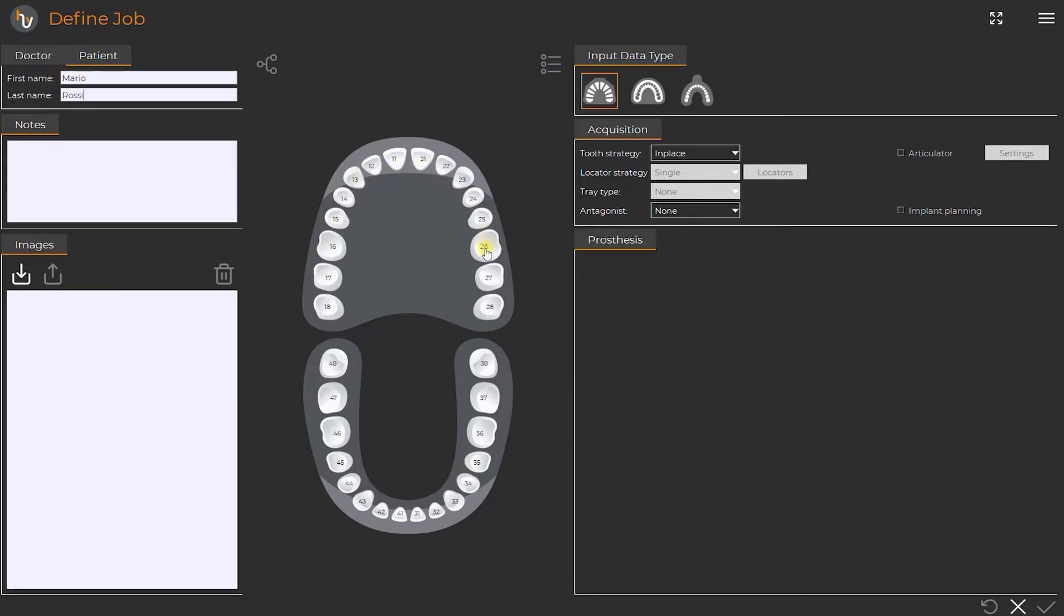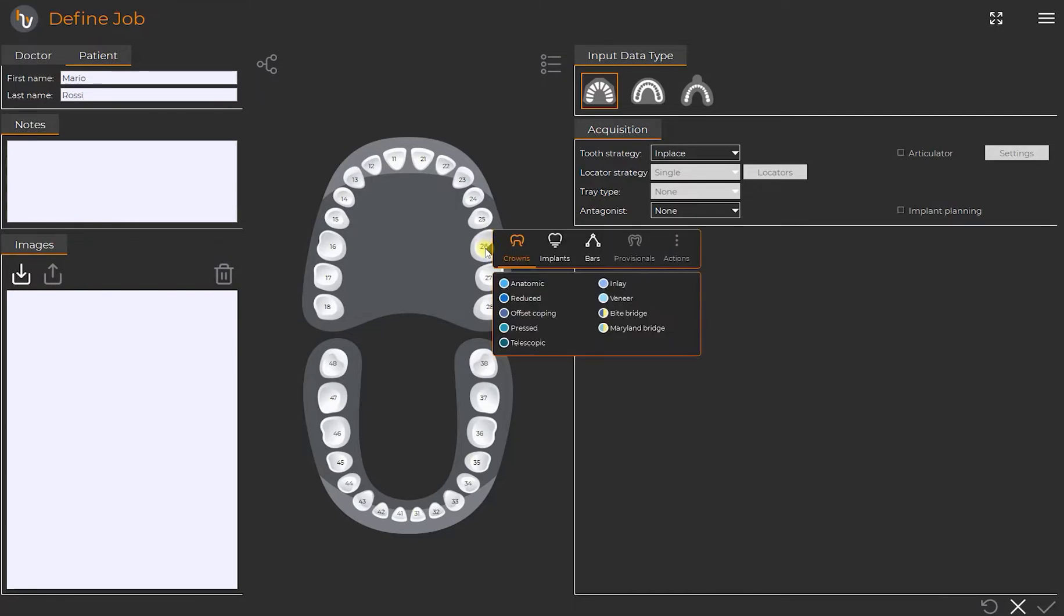We right-click and select the tooth 26. From the drop-down menu we choose the kind of fixed prosthesis we want to achieve. Crowns, implant and bars.